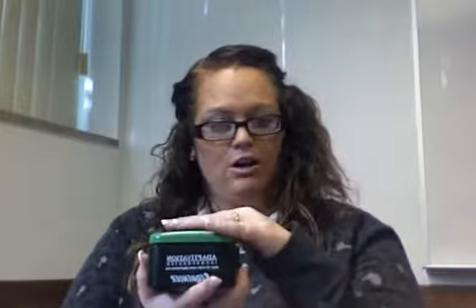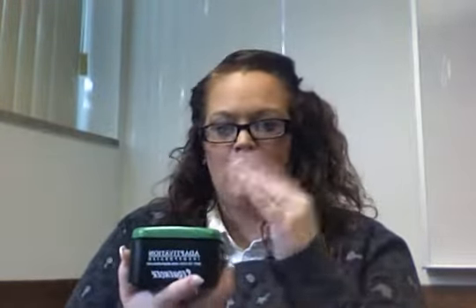This sequencer I actually really like because it's super simple, and anyone, the mom, dad, anyone can just record simple little phrases for them, and it doesn't take much for the child just to hit the top button. It doesn't mean that they need to be fiddling with things. They just hit the button and it is their voice for them.